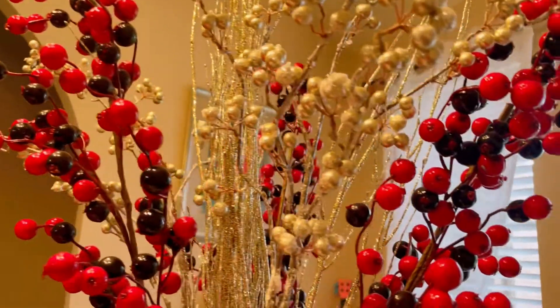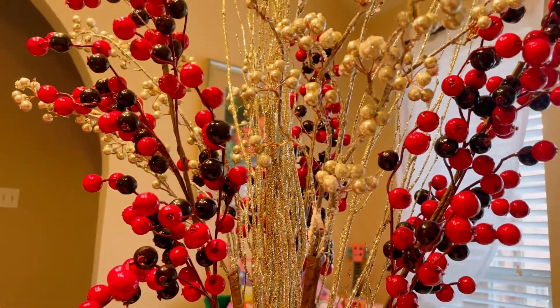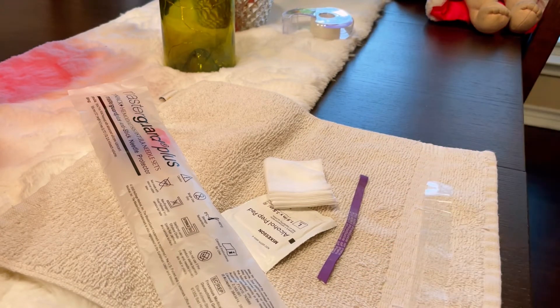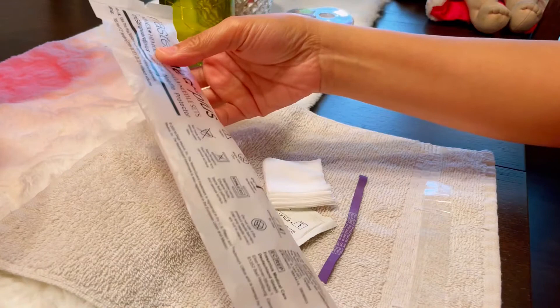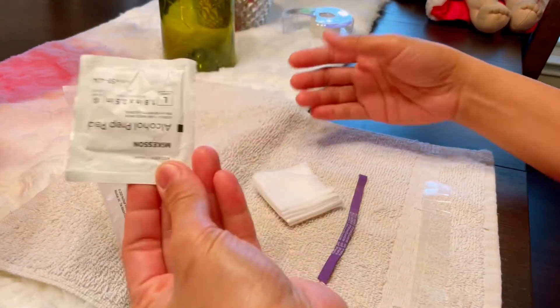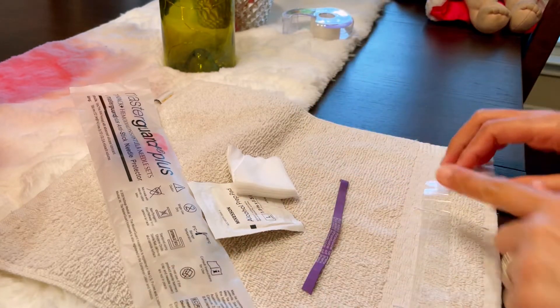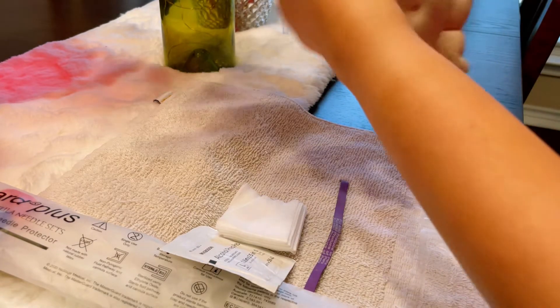Hi guys, so today I'm going to show you how to cannulate your patient's permanent access. First of all, we have to prepare and gather the supplies for that assigned patient. We have our blue pad, our sealed and opened ordered needles, two to three alcohol pads, gauze, tourniquet, and tape.